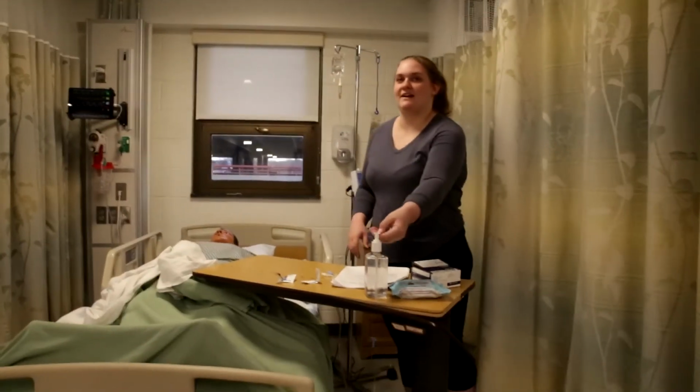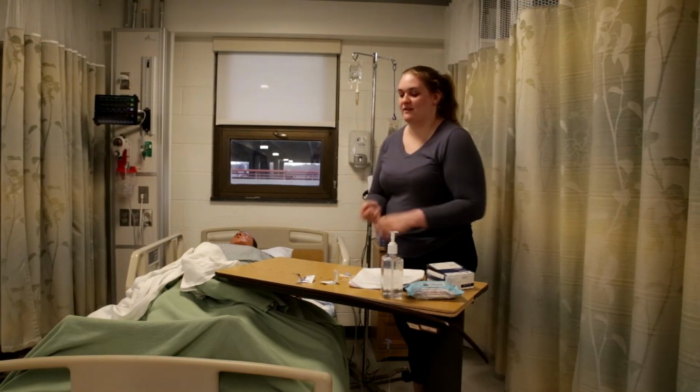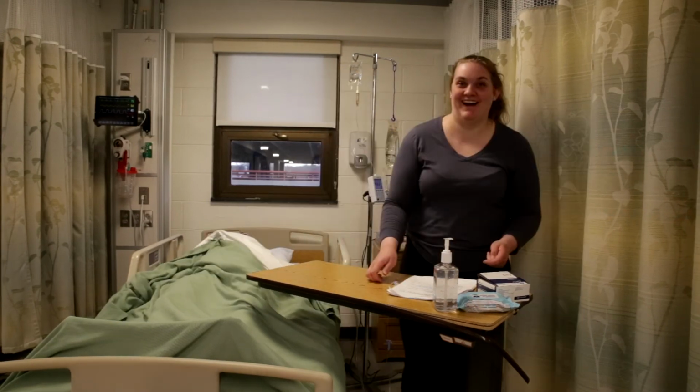Now I'm going to do hand hygiene, and I'm going to make sure my patient is comfortable, and I'm going to make sure their bed is in the lowest position. They have their call bell within reach, and document.